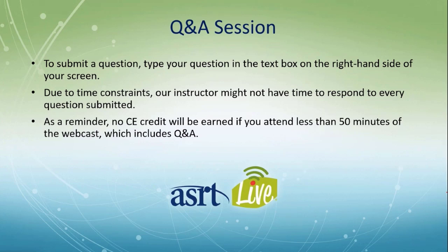I heard that digital receptors are more sensitive to scatter. If this is true, I want to know why. Well, I don't know all the physics behind it. In particular, it would take probably 15 minutes to do that anyway. But it's true that digital receptors are more sensitive to scatter fogging, and that's why we don't want to set them out in the room and so forth.